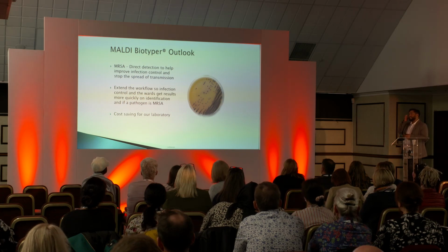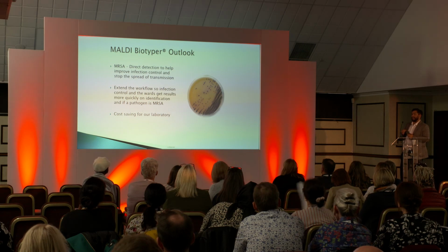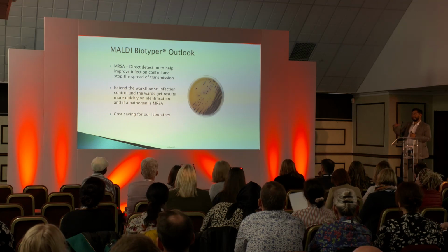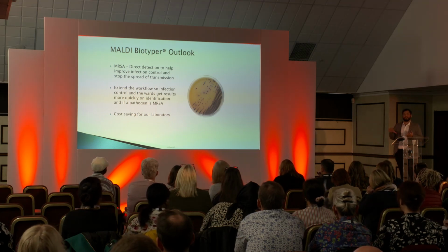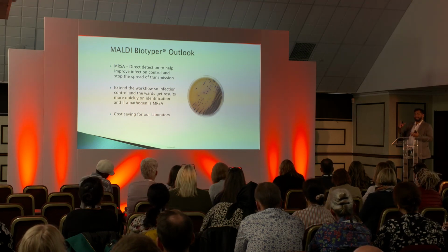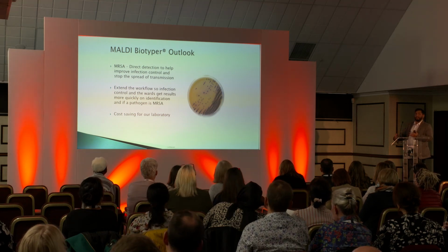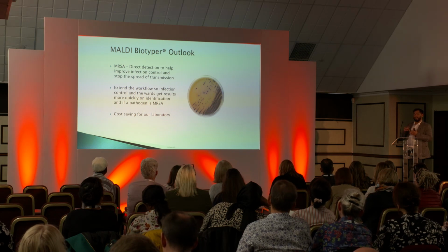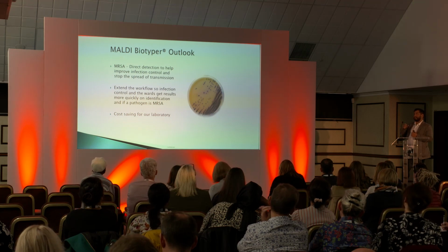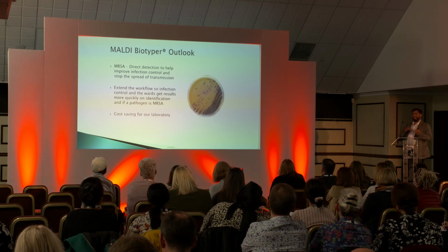So other things that we're looking to develop, so you've all probably heard of MRSA. At the moment, where I'm working, we grow it on culture, and then we do a number of tests to ID it. Malditof can tell you it's a Staph aureus, but it won't tell you it's got the resistant mechanism that makes it an MRSA. But we're working to develop that and build that in our laboratory, because we have to wait 24 hours to get that result to confirm it's an MRSA by looking at a cefoxitin MIC or disk test. If we can get it at the same time that we ID, that will again be a cost saving for the lab, and again help with infection control and transmission for patients.